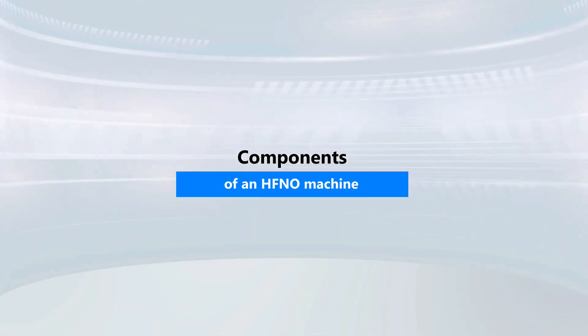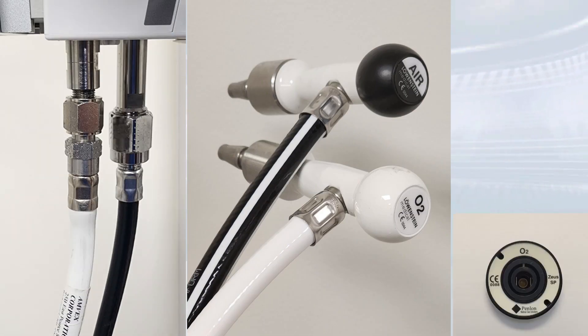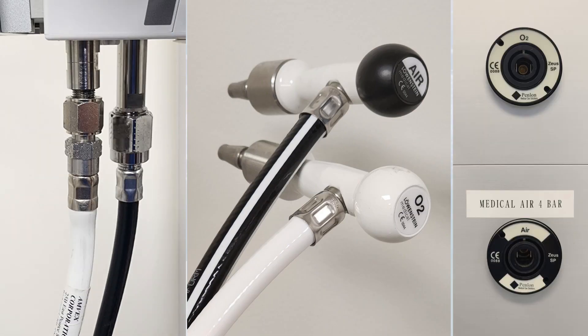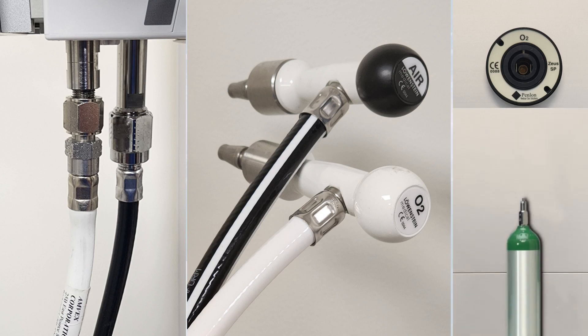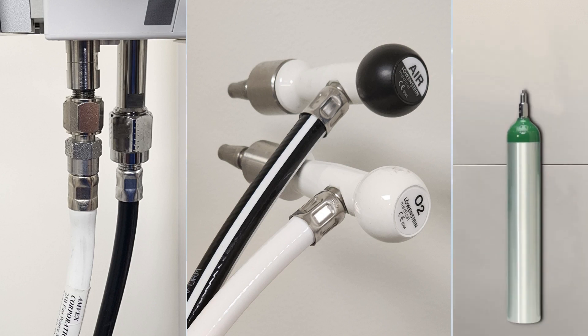First, let's see the components of this machine. Air and oxygen tubes will be connected to the pipeline sources with a pressure of four bars. Additionally, when moving patients to the ICU or recovery room, you can connect them to cylinders using this connector.